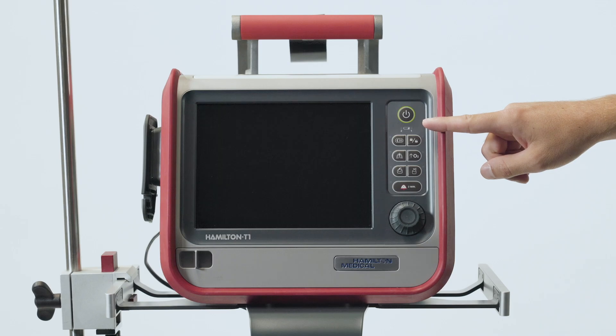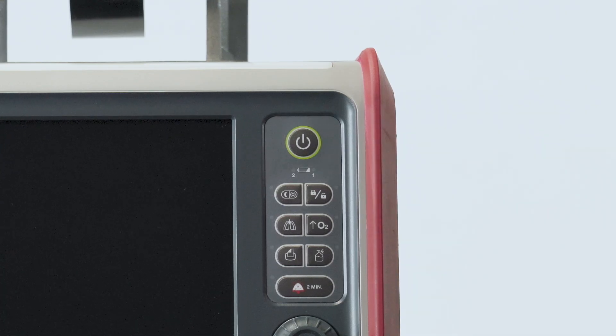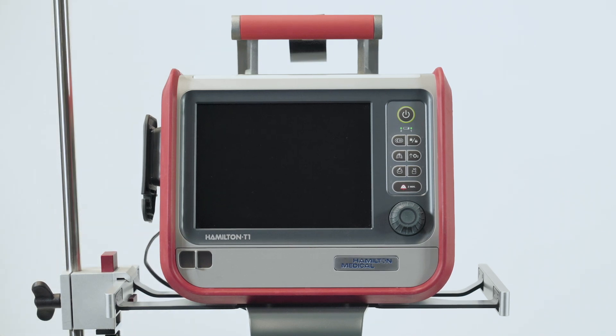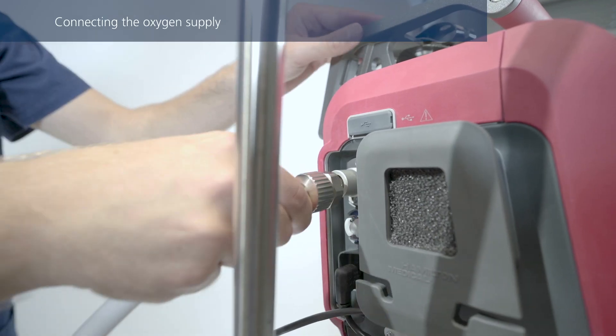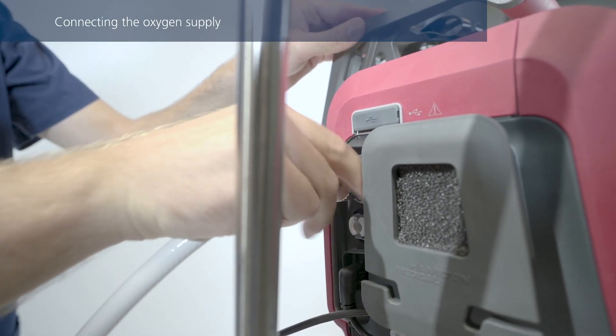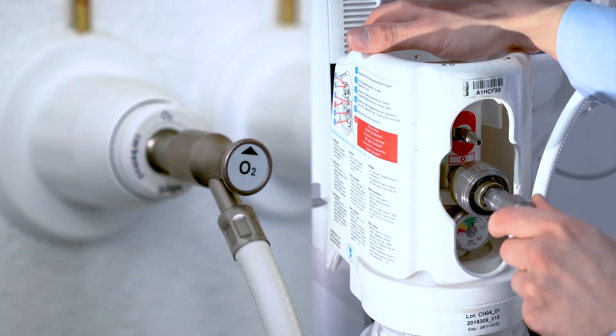If the battery is not charging for whatever reason, the indicator will stay dark. Make sure the ventilator is connected to a power source before you start ventilation. If you haven't done so already, connect the oxygen hose to the ventilator, and then to the gas supply or a gas cylinder.